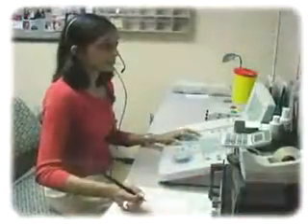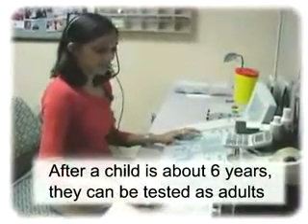After a child is about 6 years old, they can be tested like an adult.